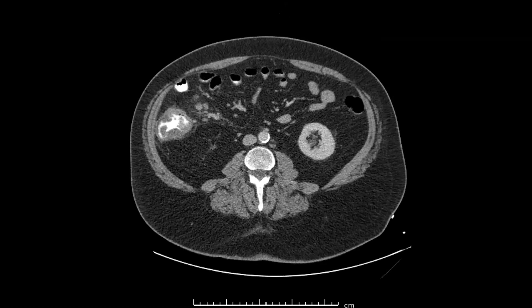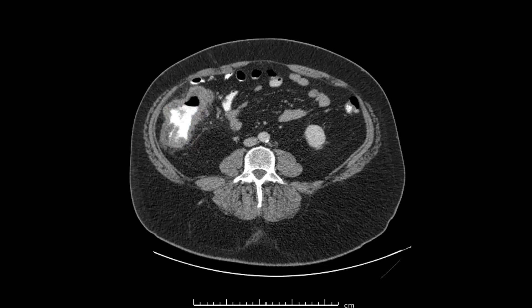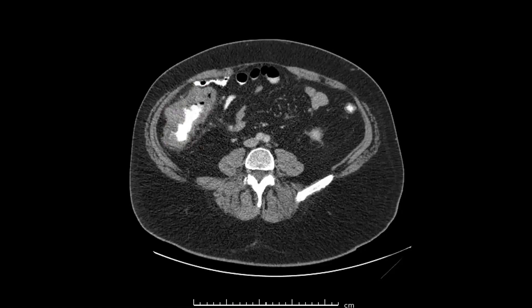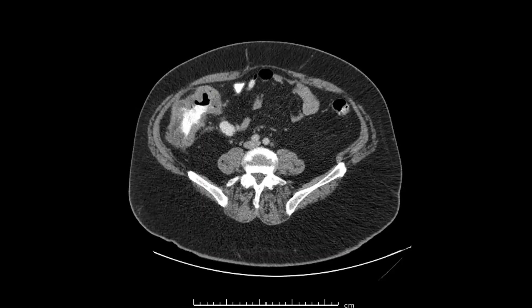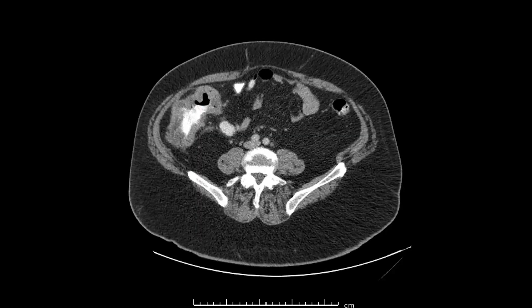Axial images showing the same findings: the mesenteric lymphadenopathy, this irregular polypoid circumferential wall thickening, and the aneurysmal dilatation of the involved colon. Notice how it's a very long segment but non-obstructing — contrast passes through this area.